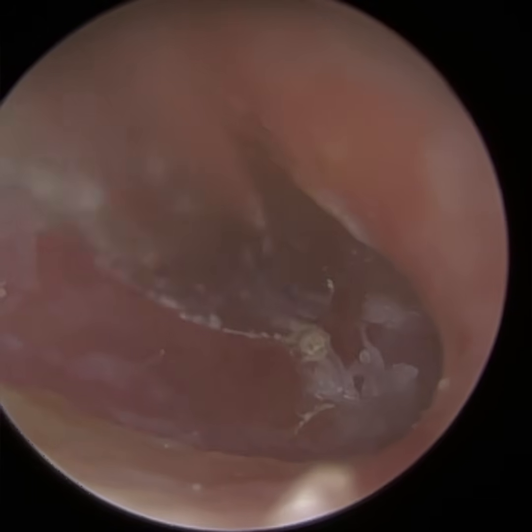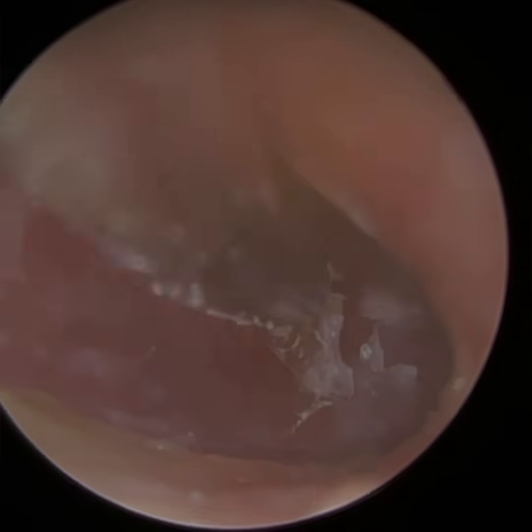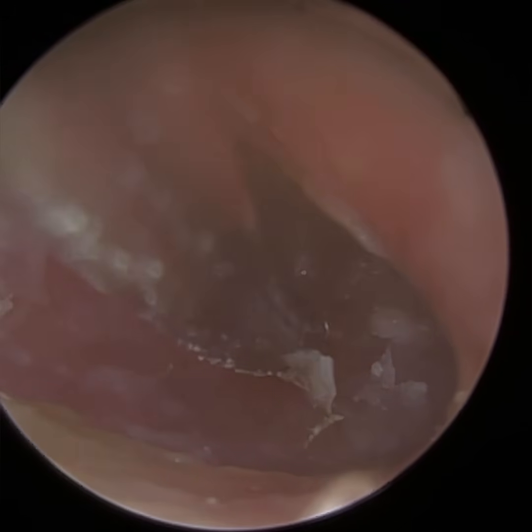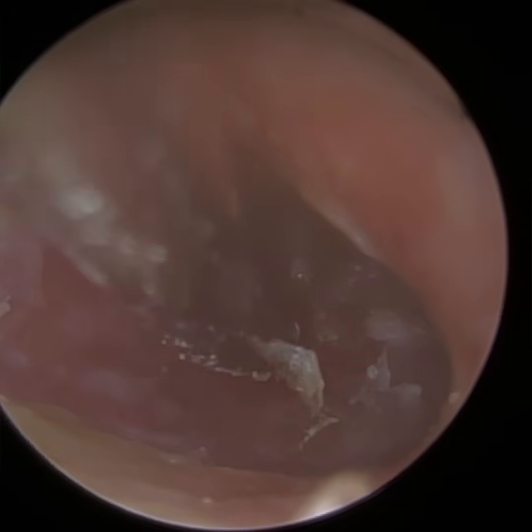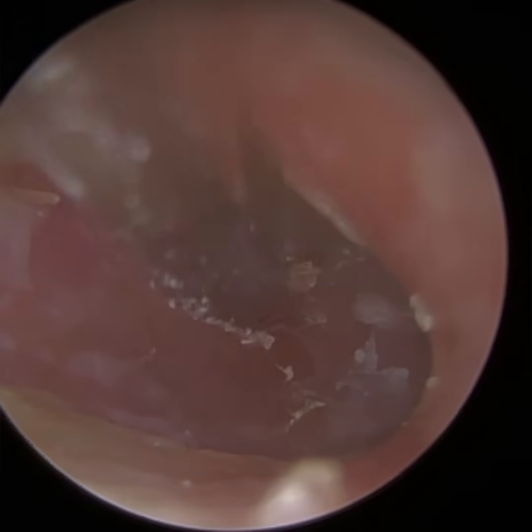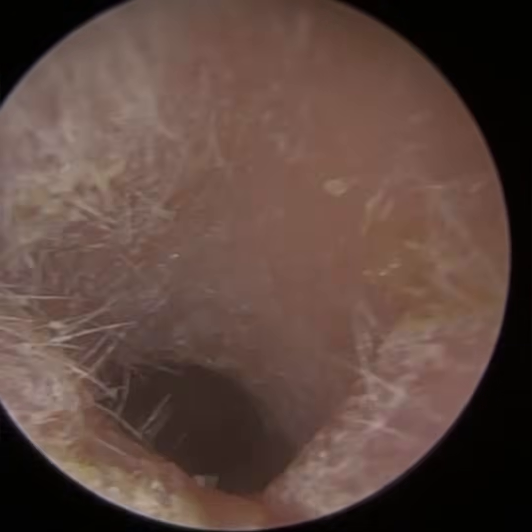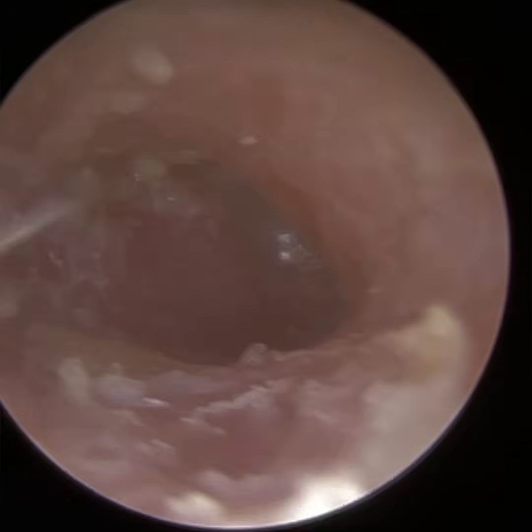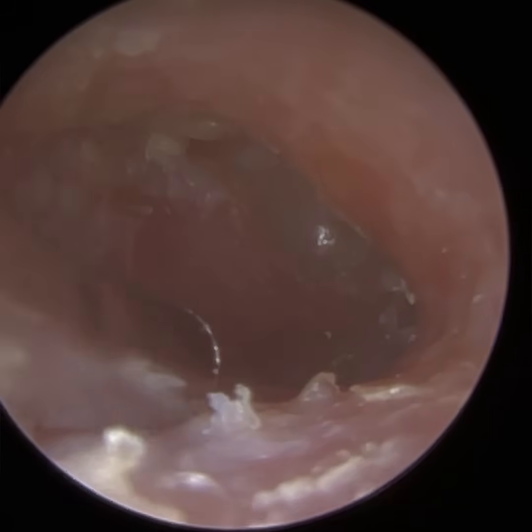I want to avoid the front part of the ear canal. So I'm using the fine end here, and there's just some dead skin on the eardrum, just peeling it away. The more debris that I can get away for this patient, the more beneficial any topical drops they're going to be prescribed will be, because they'll be making contact with the surface of the skin, and that allows a better opportunity for it to penetrate and be absorbed, to help fight any infection in the deeper layers of the skin.